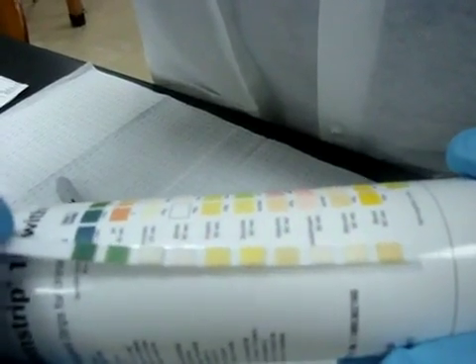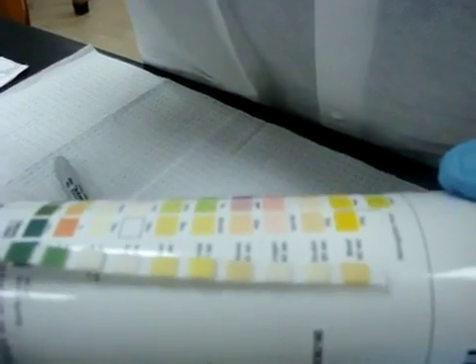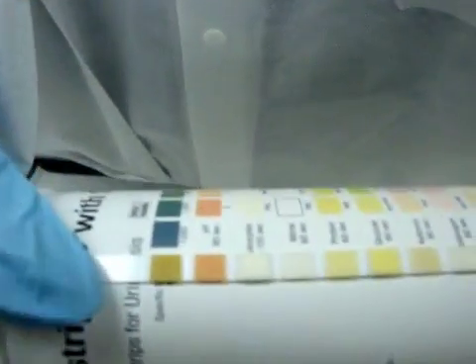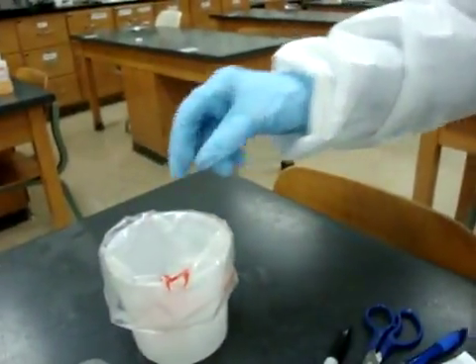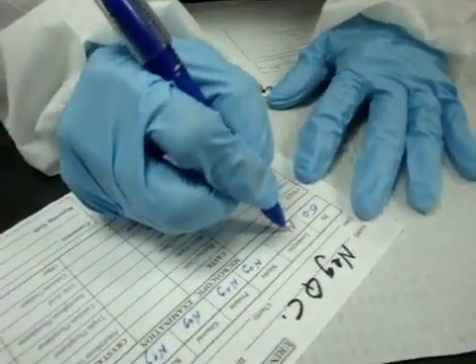The protein is negative. The ketones are negative. The urobilinogen is normal. The bilirubin is negative, and the blood is negative. Now it's time to read our leukocytes, and they are negative. We take our dipstick and we put it into the biohazard, and then we record our final reading. Negative.